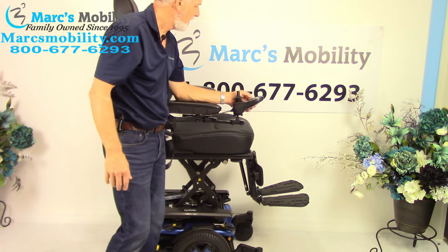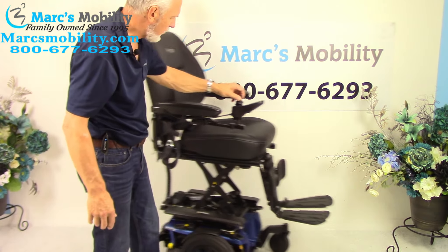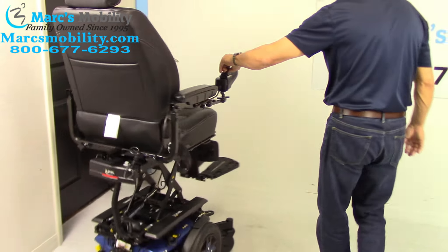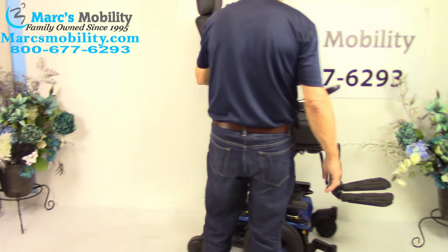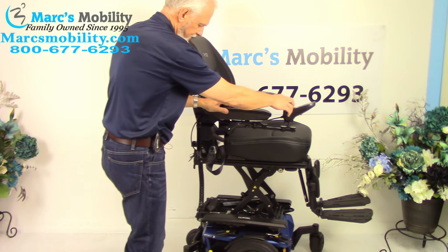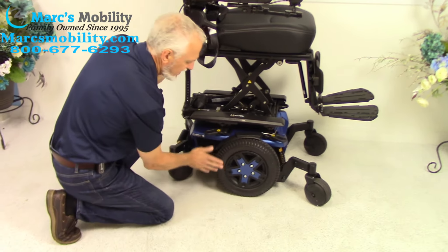With the seat elevated, this chair still drives at a really good speed. I can't show you exactly how fast it drives, but it does boogie around. That's the seat elevated — let me bring it back and look at the base.